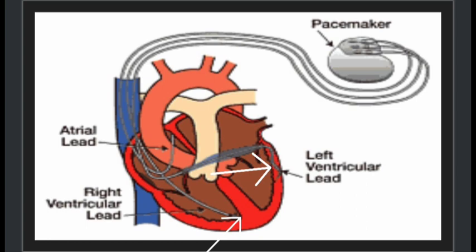What do you mean by cardiac resynchronization therapy? It is a procedure to implant a device in the chest to make the heart chambers contract in a more organized and efficient way. Now some might think dual and biventricular pacemakers look similar. What's the difference between them?